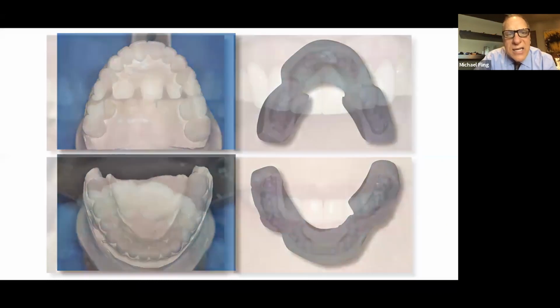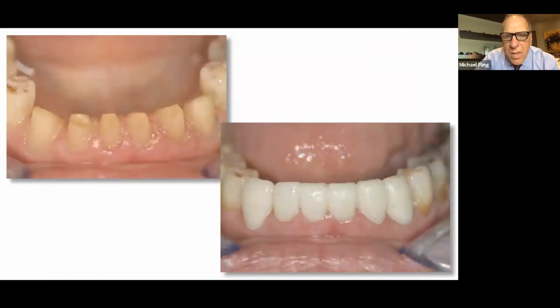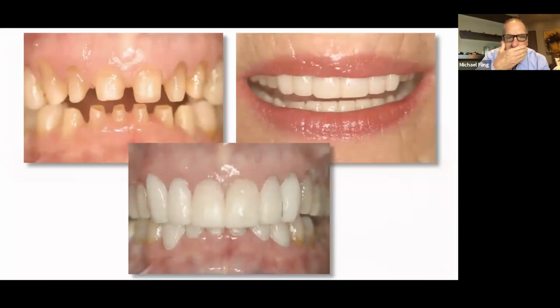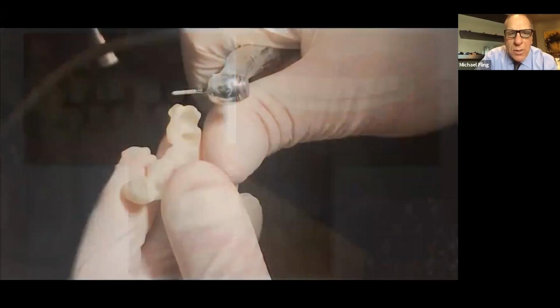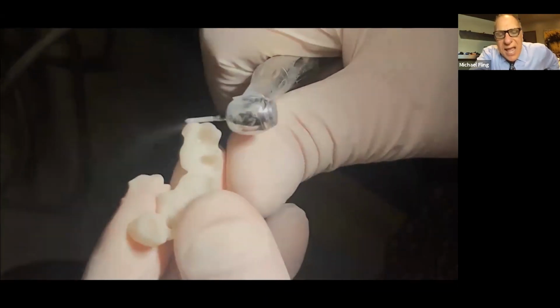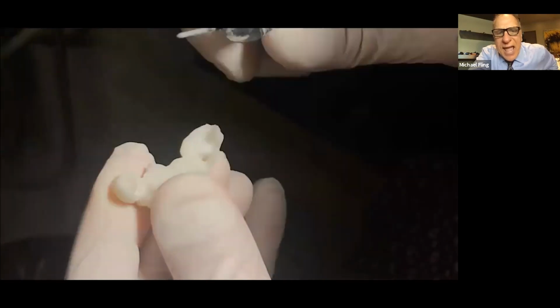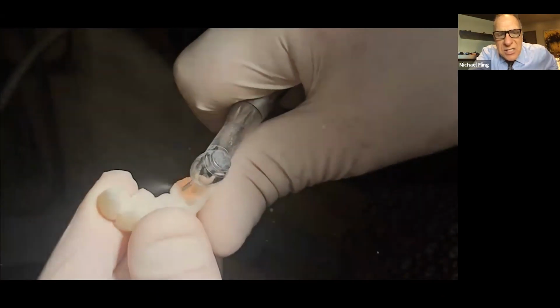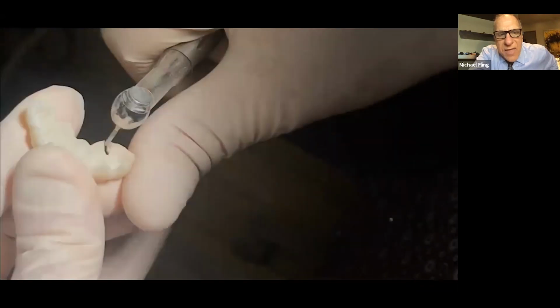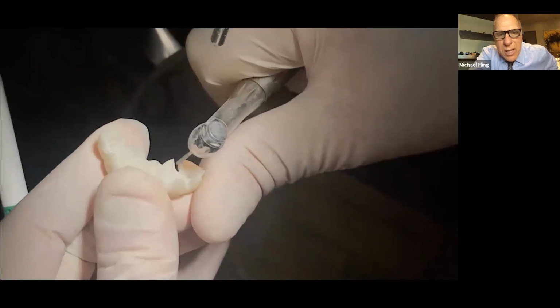So now I've got to go and take this into the clinic. I'm going to go through the same process. I make my upper anterior provisional restorations. I do the lower anteriors as we had discussed earlier. I get her coupled. When I do provisionals, I try to use a heavy chamfer or a shoulder. So my margins should be really, really evident. I use a high speed with a diamond burr to get rid of the excess bulk. I just use a diamond.